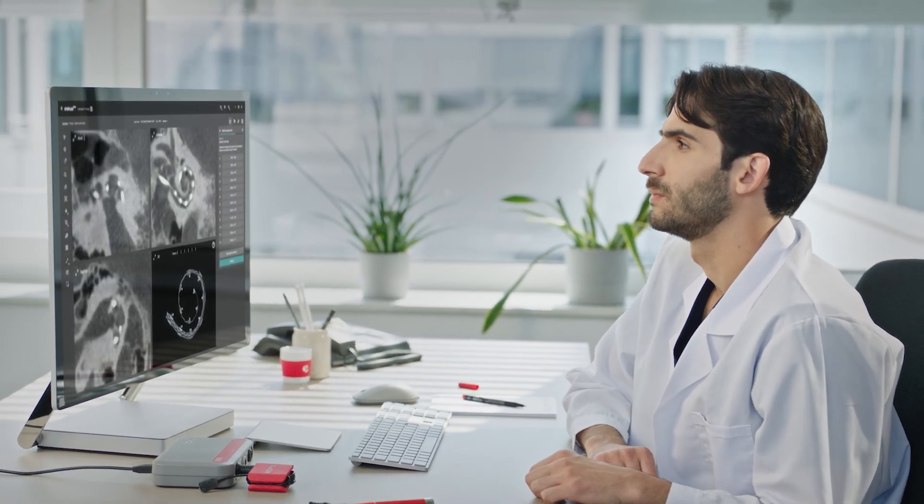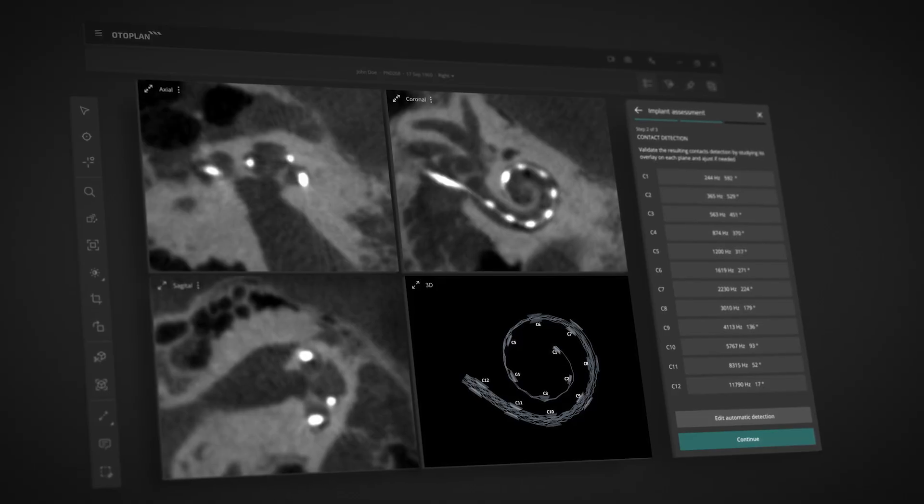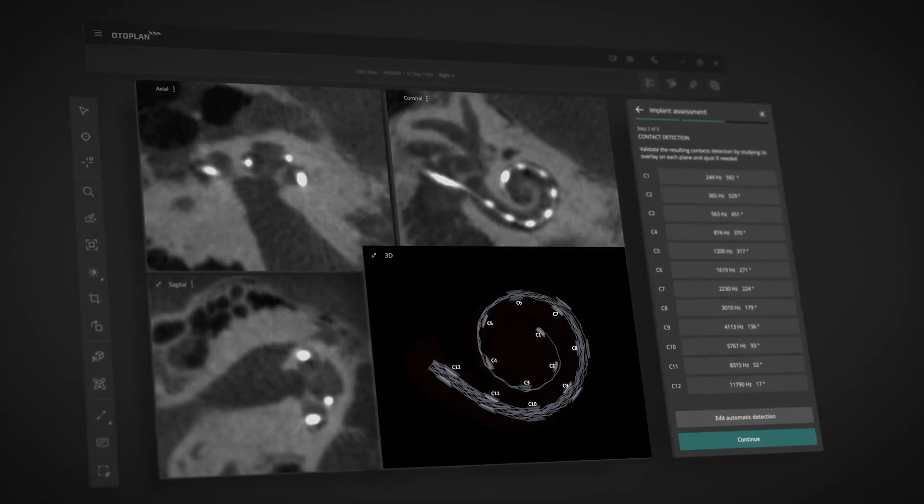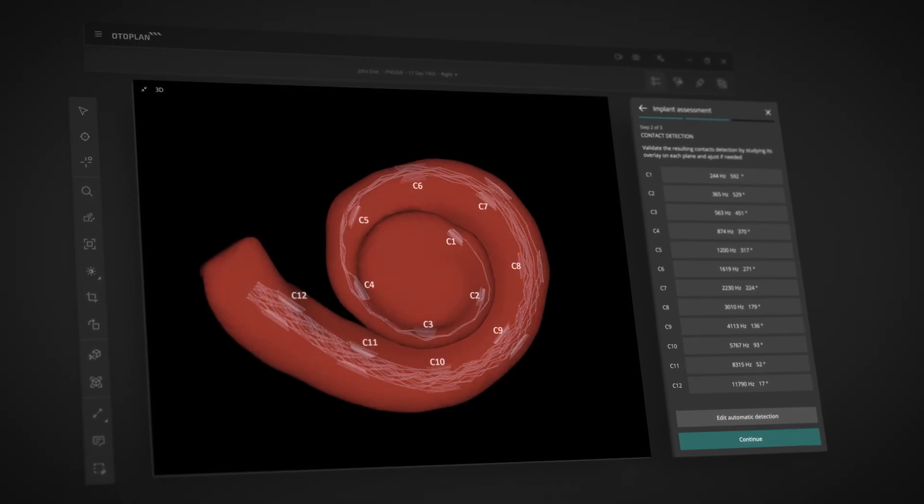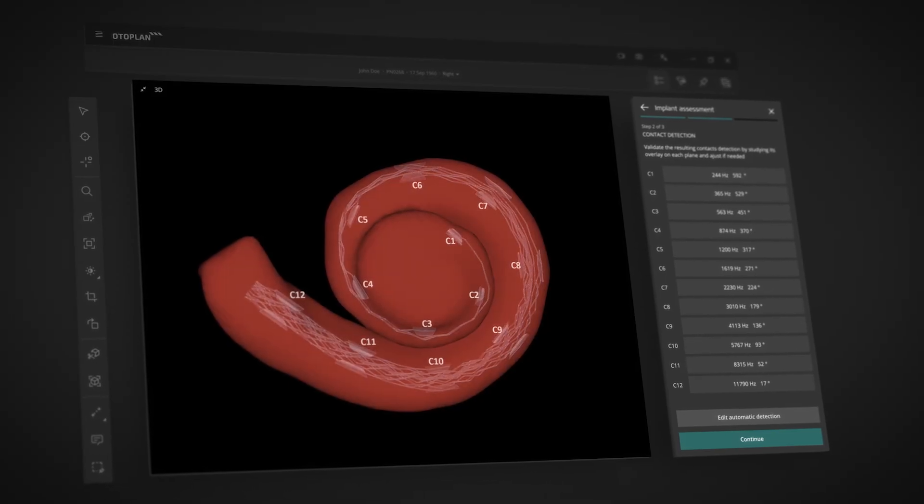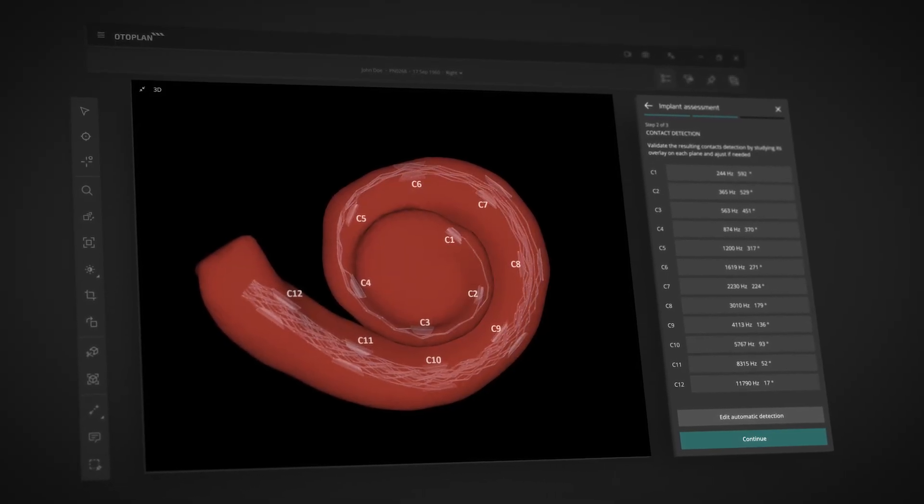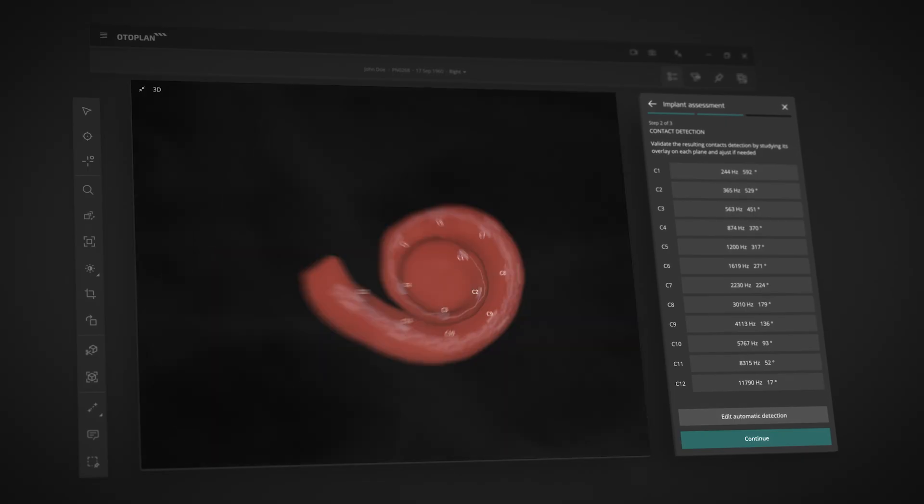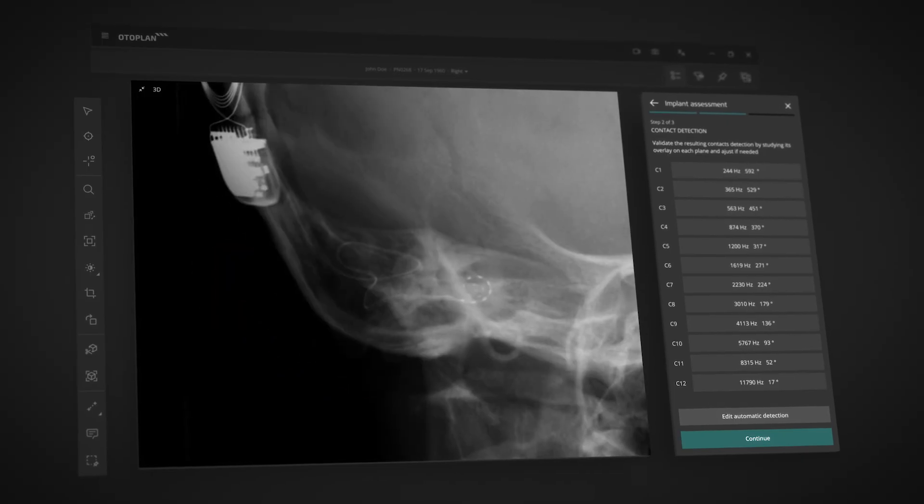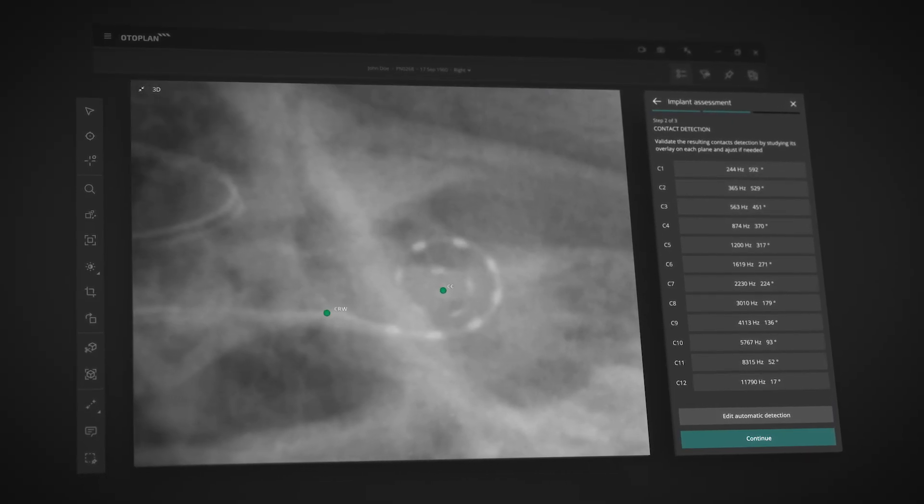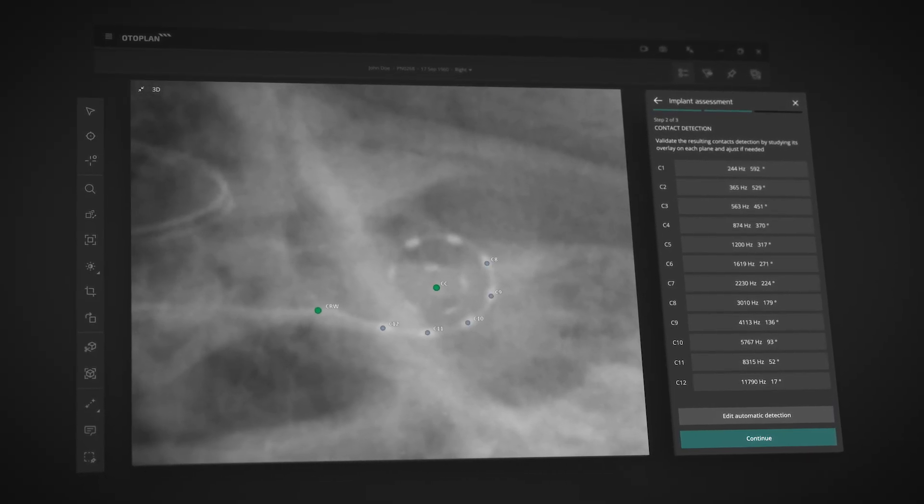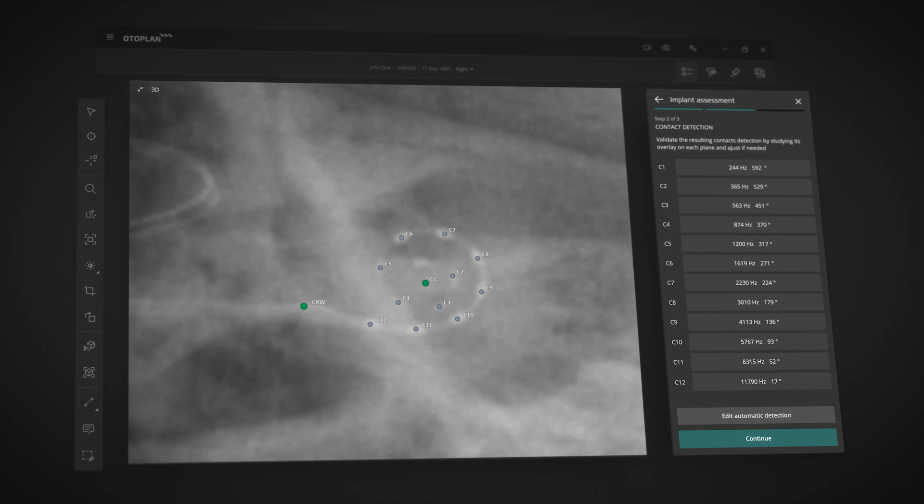OtoPlan allows you to quickly identify the post-operative angular insertion depth and tonotopic location of each electrode contact with either CT scan or plain X-ray imaging. This location data can be easily exported to Maestro for anatomy-based fitting.